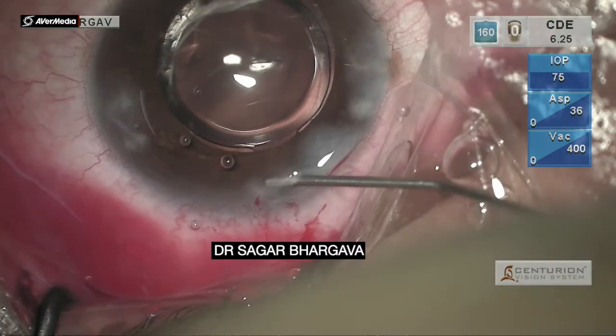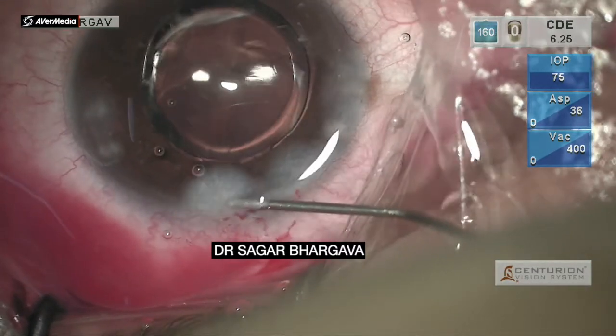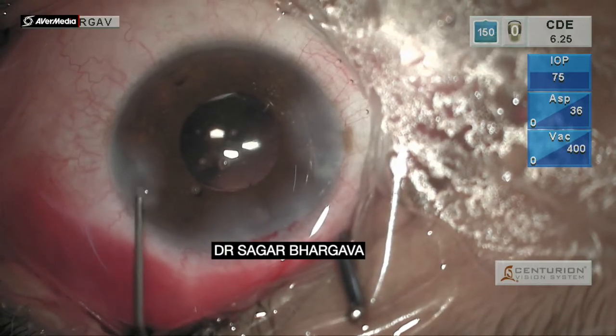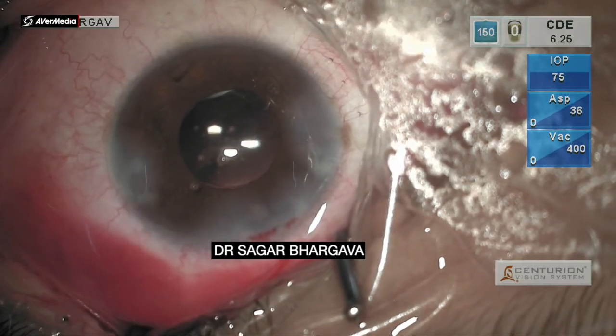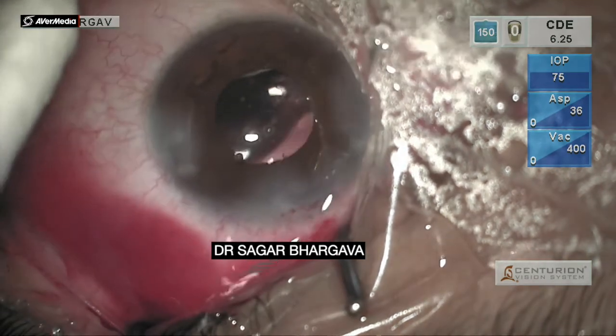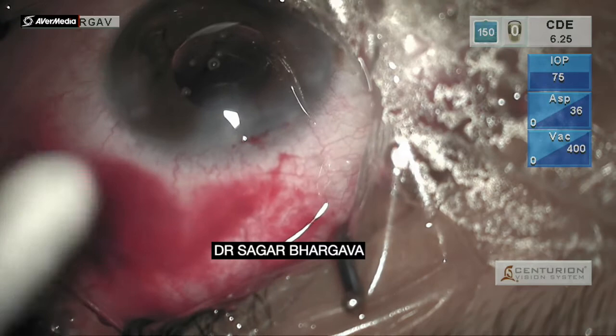Finally, the side ports are hydrated. Post-operatively, the patient did well. He achieved an uncorrected visual acuity of 6/6 and needed a correction of around plus 2.5 diopters to achieve N6. The dysphotopsic symptoms that the patient was experiencing were no longer there, and the patient was quite comfortable.